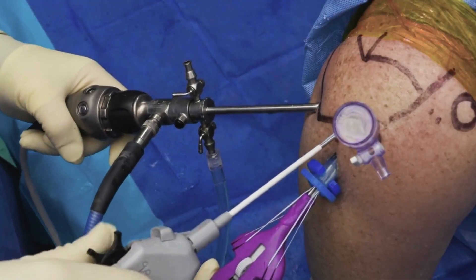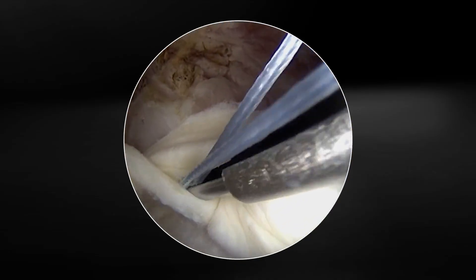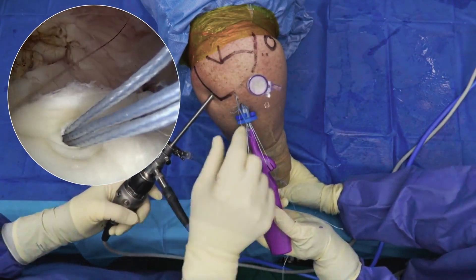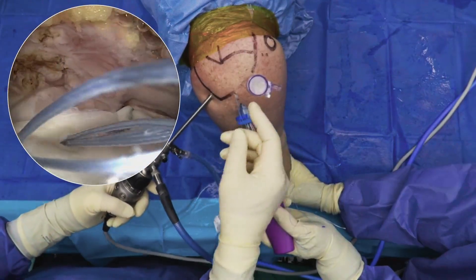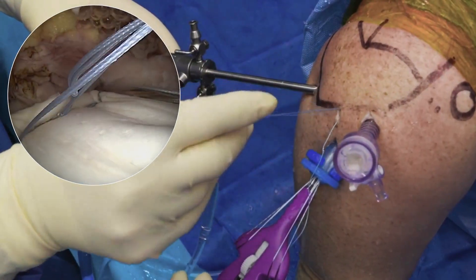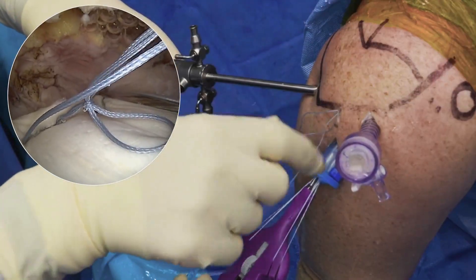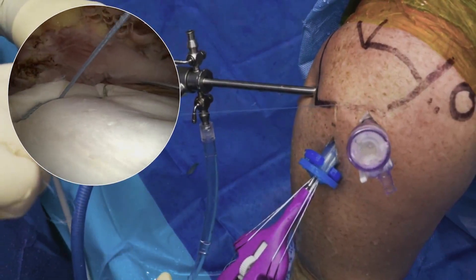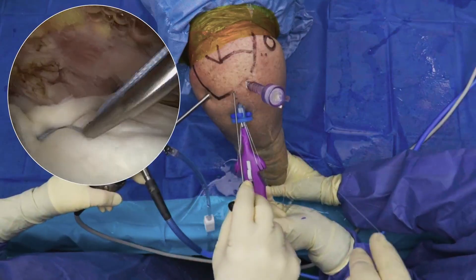A second FibreStitch RC is then utilized along the posterior medial aspect of the graft. The device is withdrawn, and the second implant is placed. The inserter is gently removed. The suture complex is gently tensioned to set the implants. The horizontal suture is secured by placing a finger in the loop outside the shoulder, and gentle tension is applied. The pole suture is then used to further secure the self-locking mechanism. Finally, the tension cutter is advanced over the top of the knot to further tension the implant and cut the suture.